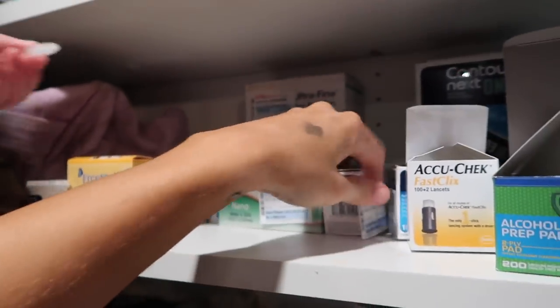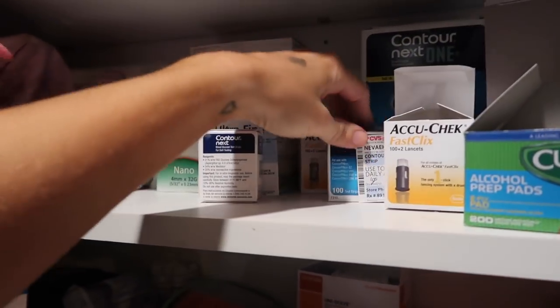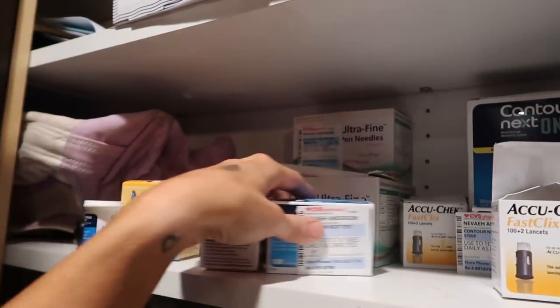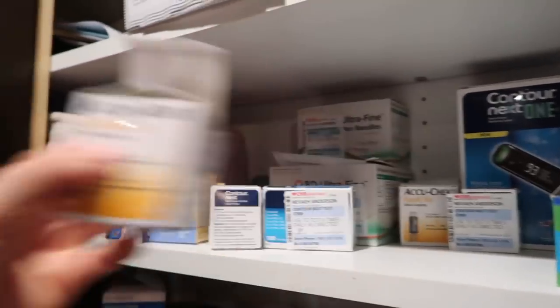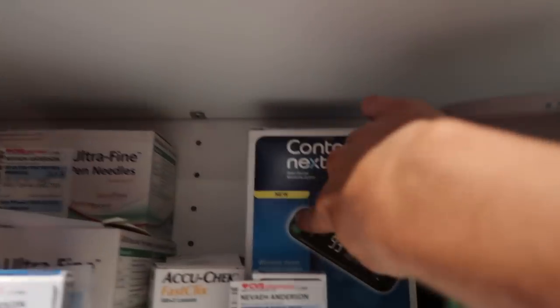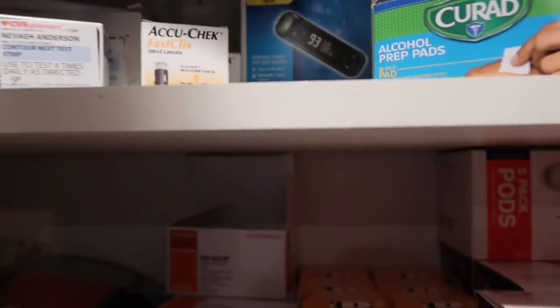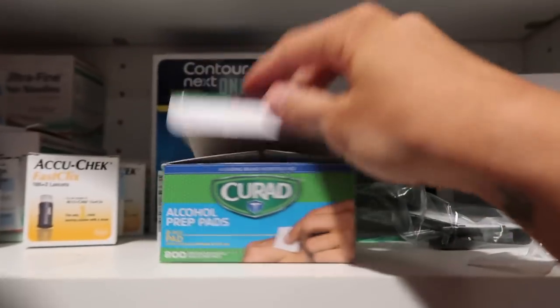These are the strips that you take to school, right? No, I take these ones. So we have those and then we have these — these are lancet things to change for the little poker, for her lancet. There's a lot in there. And then this is just a blood meter that we had extra. Alcohol pads.